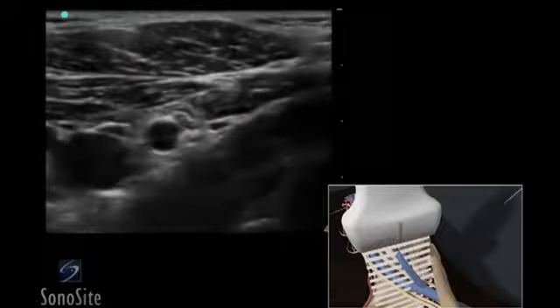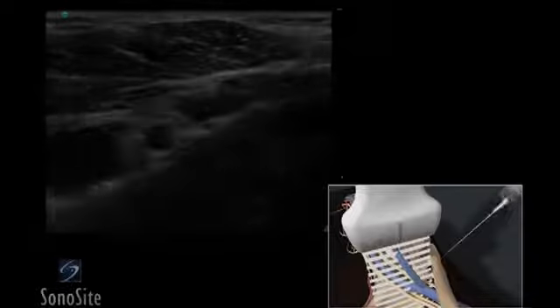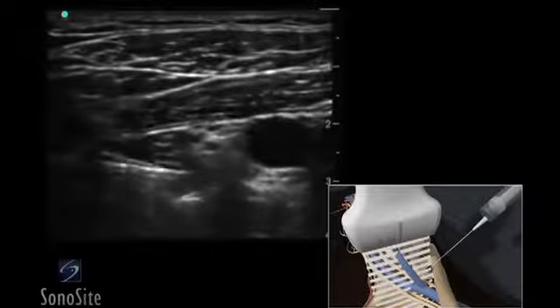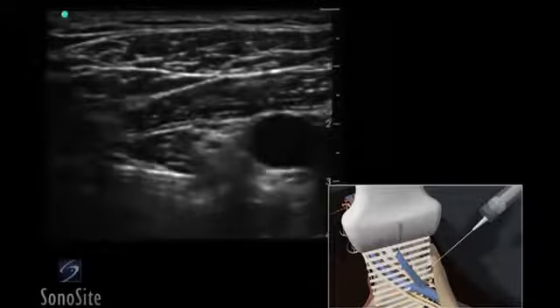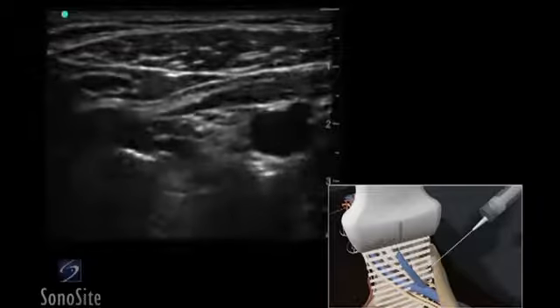The needle is positioned 2 centimeters cephalad to the transducer and advanced using an in-plane technique. The needle path is directed over the clavicle and through the pectoral muscles. The initial endpoint for the needle is immediately posterior to the midpoint of the artery.